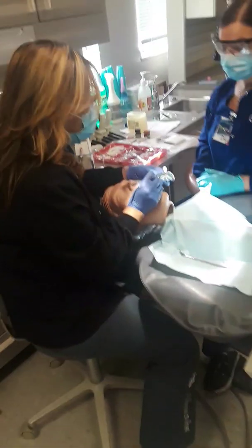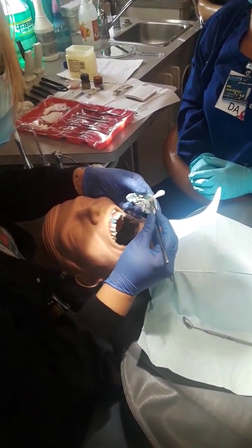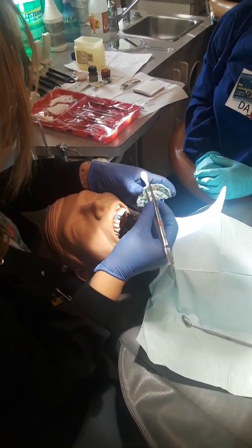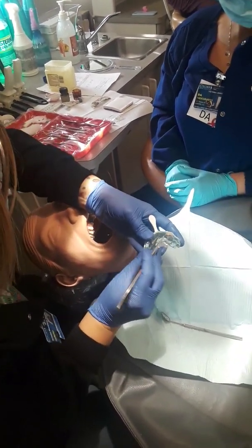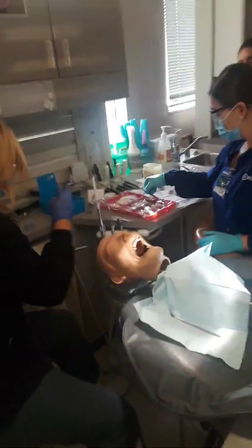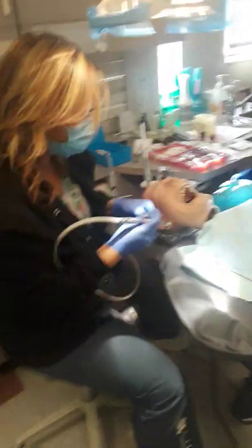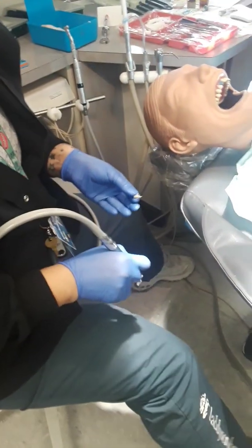So now I'm just trying to carefully get my temporary crown out of here without destroying our prelim. All right, and I got my temporary crown. I'm a little more advanced, I can use my high-speed handpiece. You guys will start off with your slow-speed acrylic burr. Turn off the water.